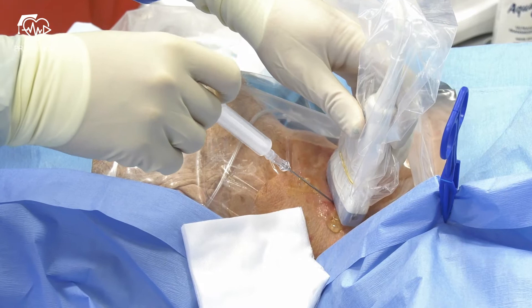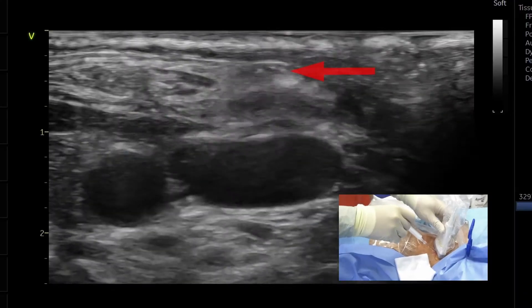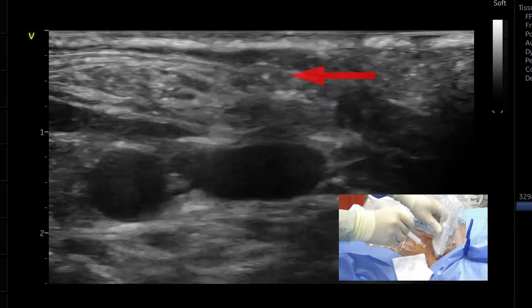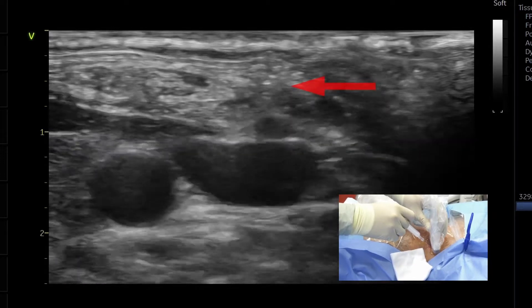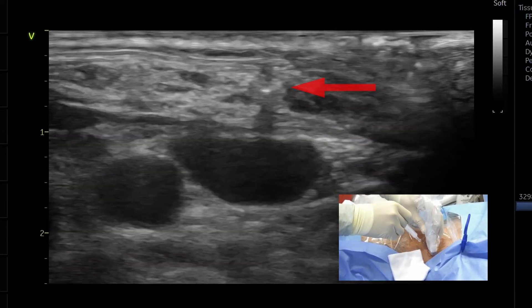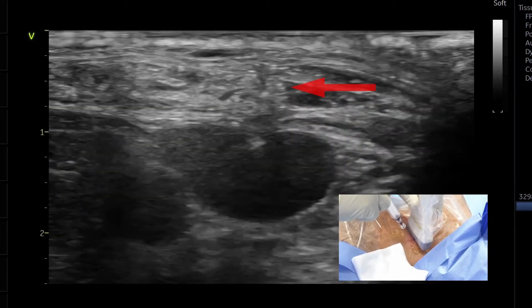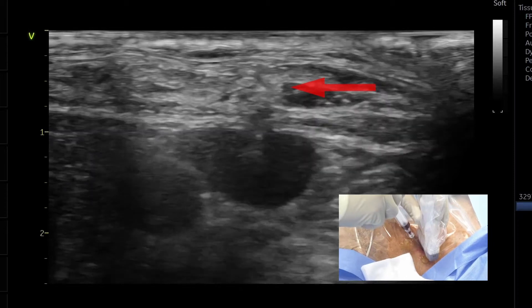Approach the introducer needle at approximately 45 degree angle. The image of the needle tip needs to be followed all the time. Never advance the needle if you are unsure of tip position. Tilting and rotating are common movements of a probe that help to optimize the visualization of the needle tip.